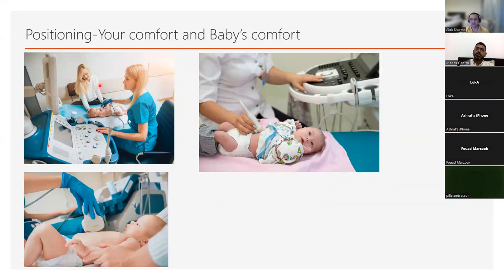So a few things that I can do is I can get the arms lifted and I can scan through the posterior axillary line. And that'll give me a significant view, especially if I'm doing what I call longitudinal or perpendicular scanning of a significant amount of the lung areas and the lung spaces.